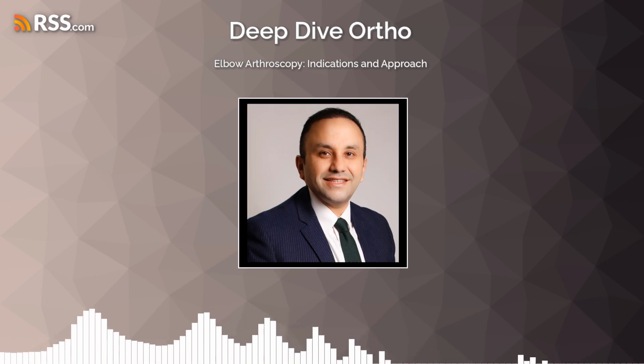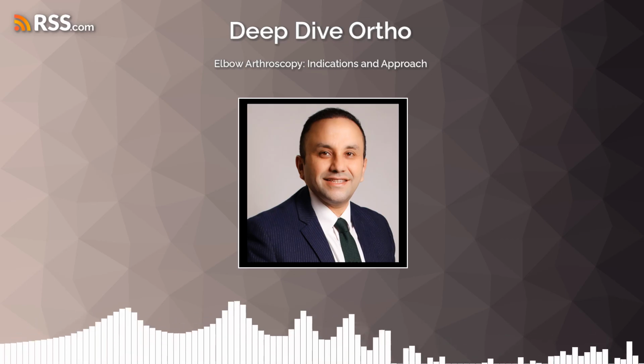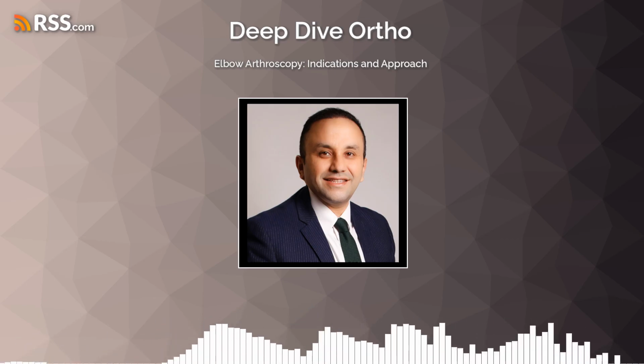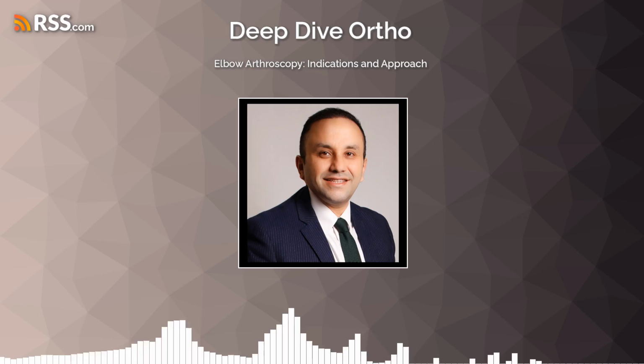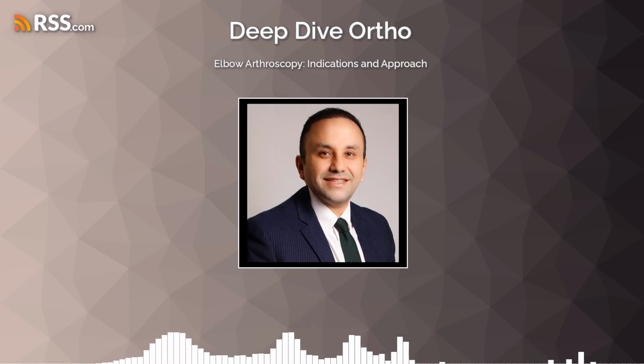Importantly, all lesions with exposed bone are treated with abrasion chondroplasty to stimulate a healing response in the area. So you're not just removing the problem, you're actively trying to promote healing in the bone beneath the cartilage. What if there's significant bone loss, though? Can you rebuild that arthroscopically?